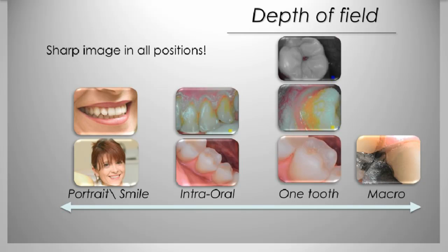When you go to the next one, which is called intraoral, this is where I am a lot. As a hygienist, I can put that camera, as it shows here, right down on the linguals of the lower anteriors, and I can show the patient the color differences. You can see it's slight here. This patient actually isn't that bad in our world of dental hygiene. Any hygienist out there is probably thinking, oh, wow, I wish it was that easy. Those are my patients all day long, because that's not very hard. There's pretty much minimal calculus here, as you can see by the orange and yellow.